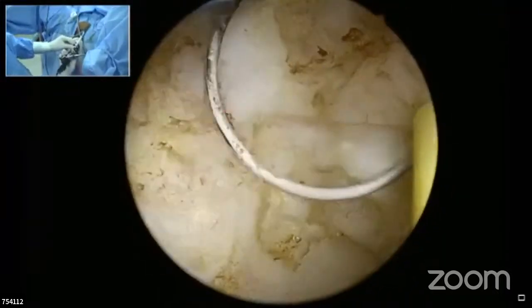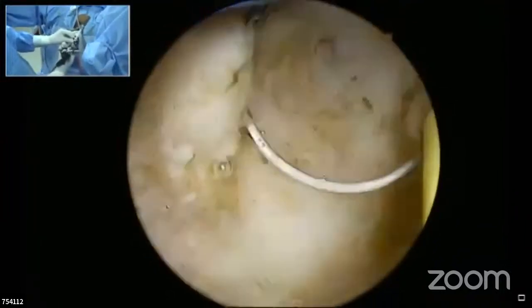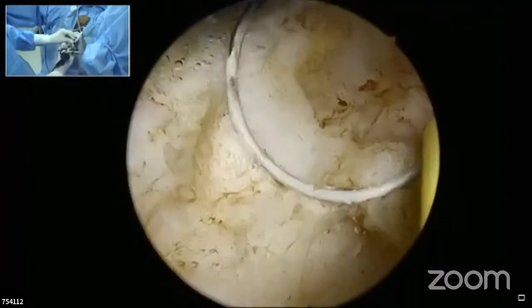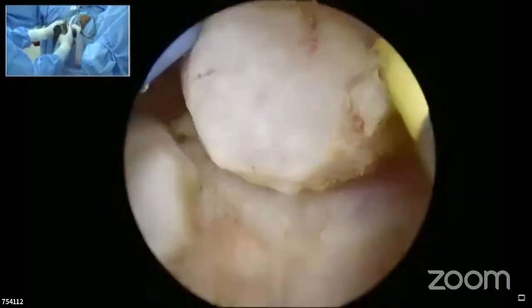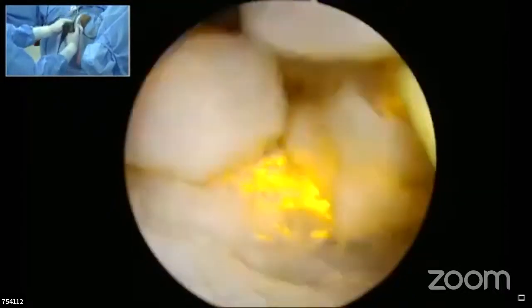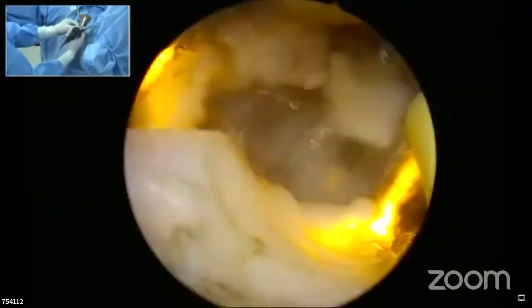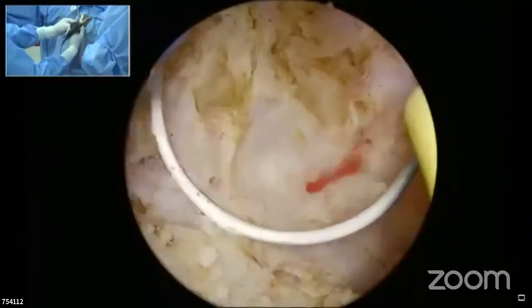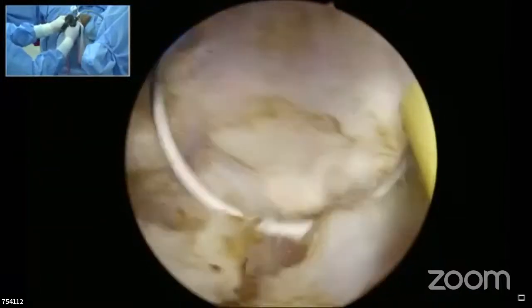Unfortunately, what I have been noticing is that there is a lot of fear factor amongst the youngsters regarding TURP, and they feel that there is an impending perforation that might happen very early in the procedure itself. So, irrespective of the technique, I think that fear has to go, and the intent of resecting completely to the capsule at all the places has to be developed, instead of creating a channel. That will help us proceed and develop ourselves into better resectioning people.